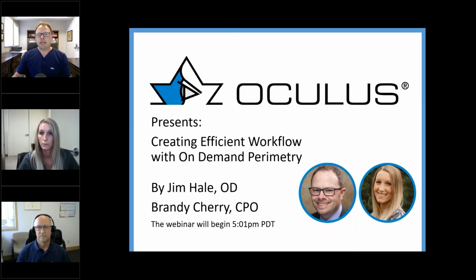One thing I was just going to point out is that I've been hearing from the staff that they really love this unit. From a COVID perspective, the lens just doesn't seem to fog up with our standard Humphrey. The lens is right there. It fogs up with the masks. The new unit doesn't. It's easier to disinfect. Flows just better. The laptop's actually portable, so you can run the machine at a distance.